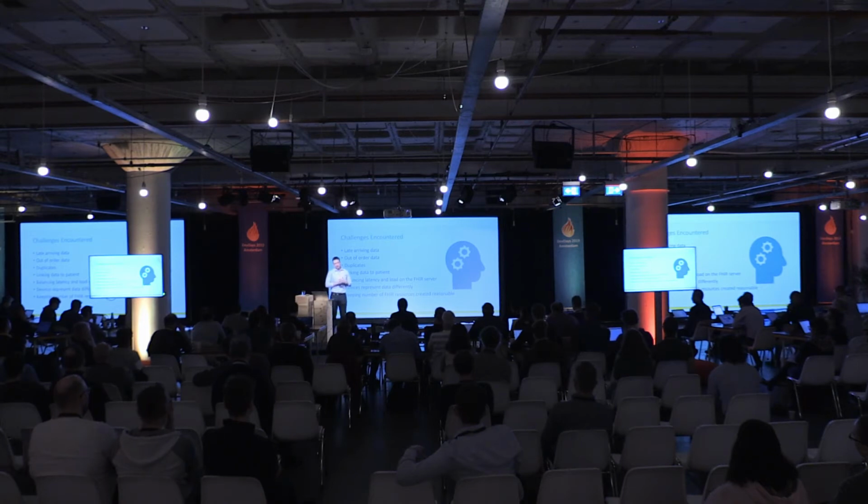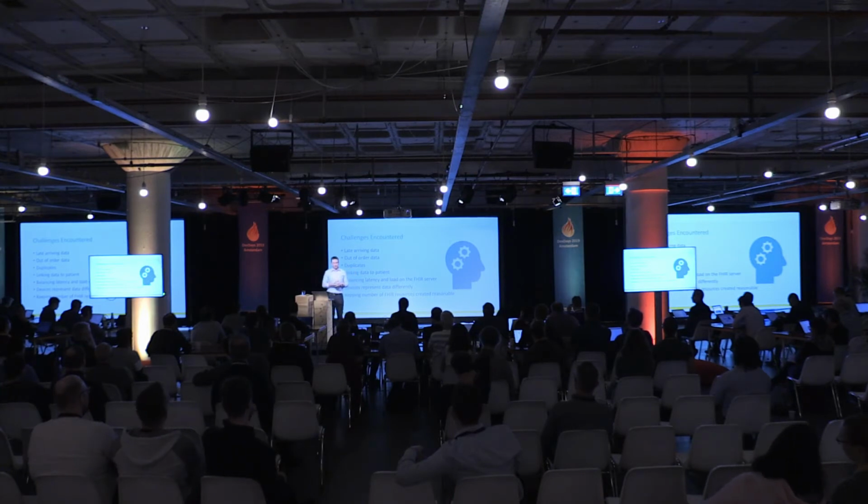There's also an interesting tension point of balancing the latency of the data that you're collecting and the load on your FHIR server. The FHIR server that we're loading data to is ideally not just for the IoMT data streams. It's serving other workloads in a clinical setting.